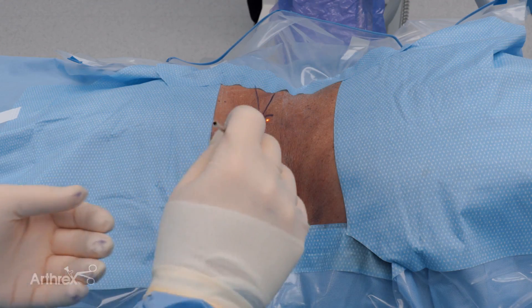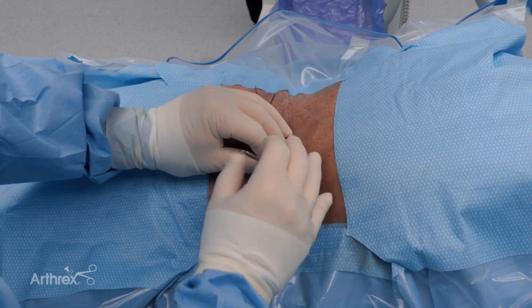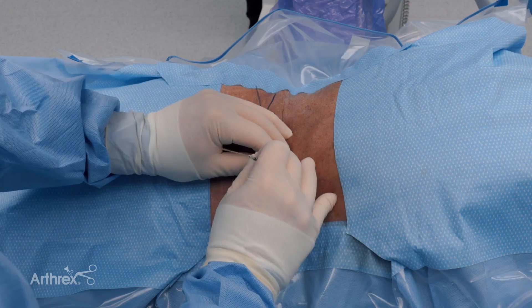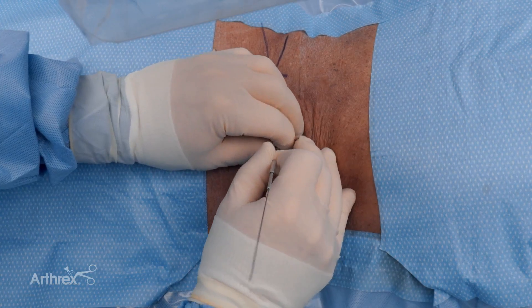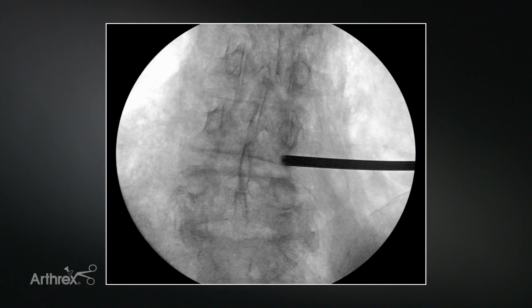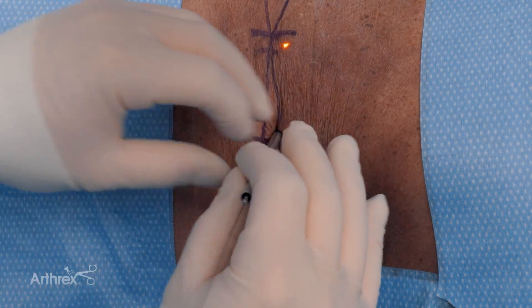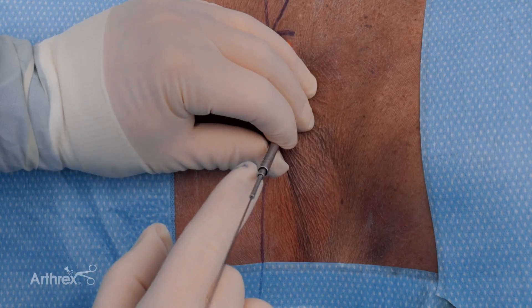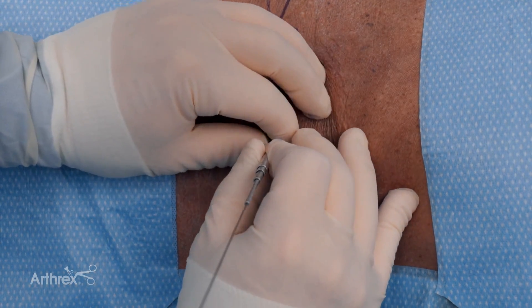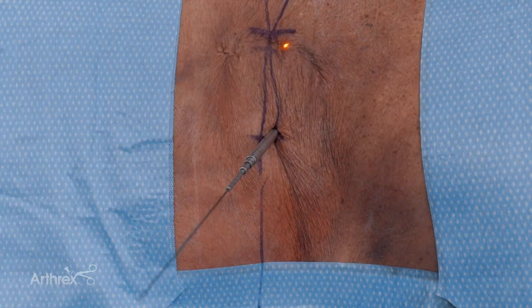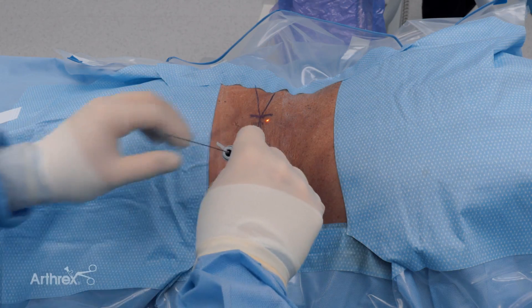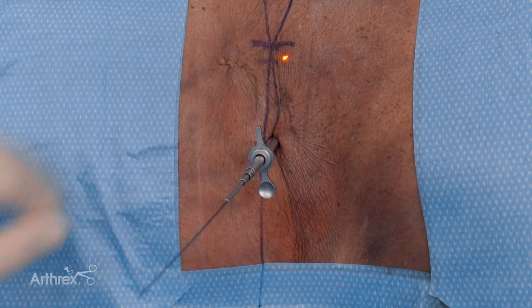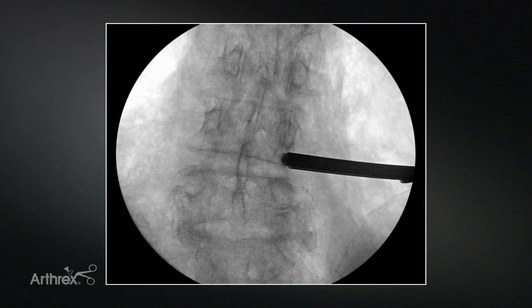Now we're going to go with the next size dilator. As we work our way up, it's possible that one of these hangs on the facet and we can't pass ventral. We see that one's hanging a little bit — I'm going to rotate and put a little downward pressure and it pushed in pretty easily. We're still able to advance it to the medial pedicular line, so we're still good in terms of our access to the foramen. Here's the final dilator — I can tell I'm not sat down all the way, so I'm going to push and rotate and I feel myself drop in. We're going to insert the cannula now over the dilator and advance it into the foramen, and we can see that sits down fairly well.